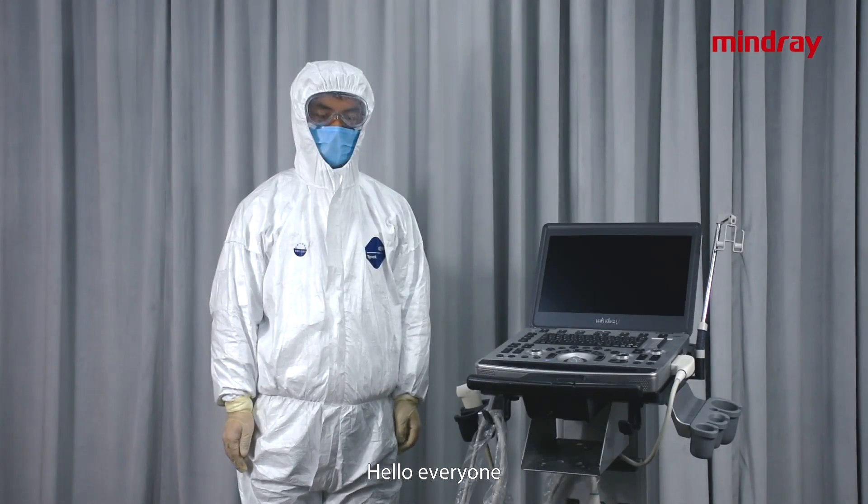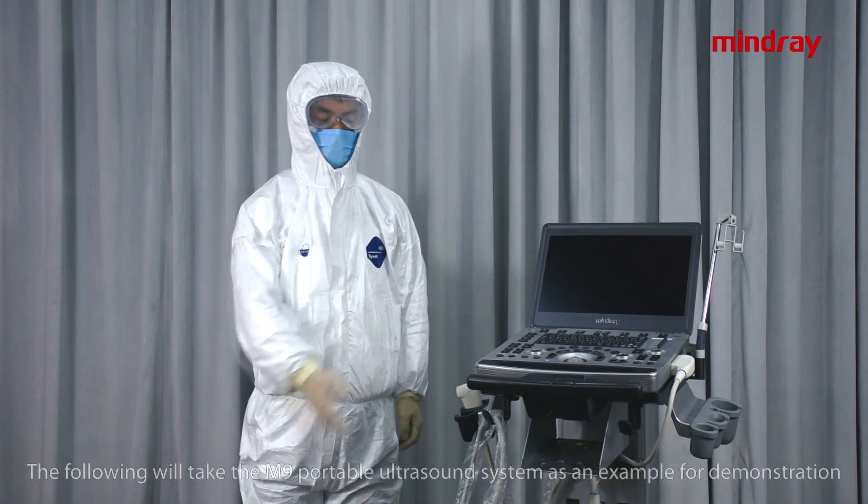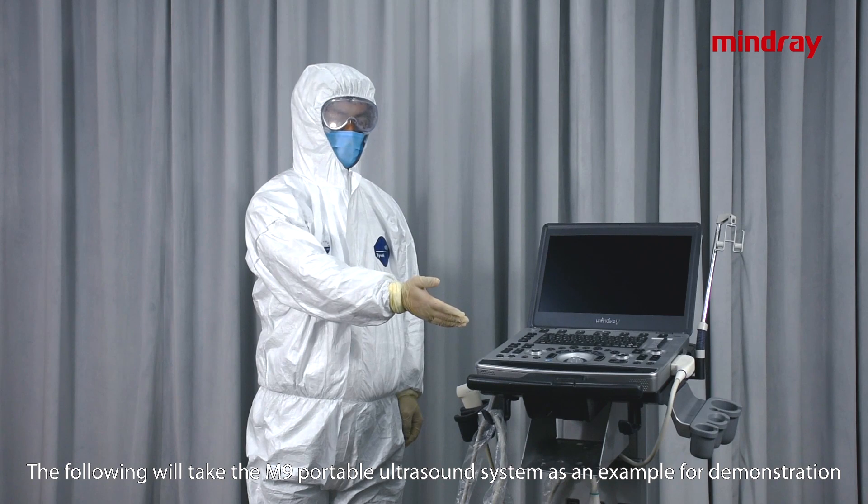Hello everyone. Today we will introduce the cleaning and disinfection operations of Mindray ultrasound equipment. The following will take the M9 portable ultrasound system as an example for demonstration.